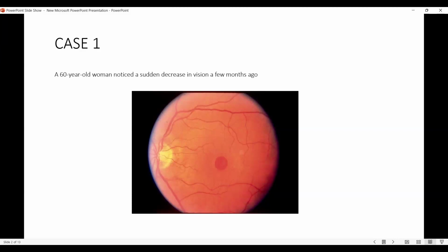So, definitely, if you are telling, you have to tell. Mostly, it is a red laser. The aiming beam is red laser, and it is around 633 nanometer. I'm asking, can this kind of large round lesion be caused by a solar retinopathy? Sir, it is unlikely because solar retinopathy will mostly cause a pigment mottling kind of appearance, not a big pigmentation like this. It will cause a subtle central white dot or some discoloration in the center of the fovea.